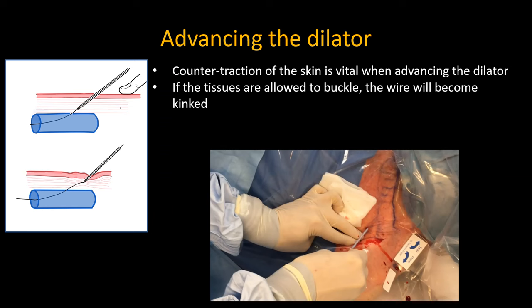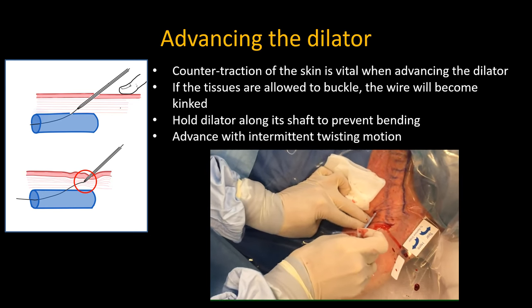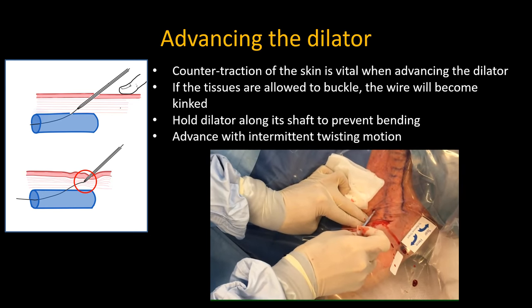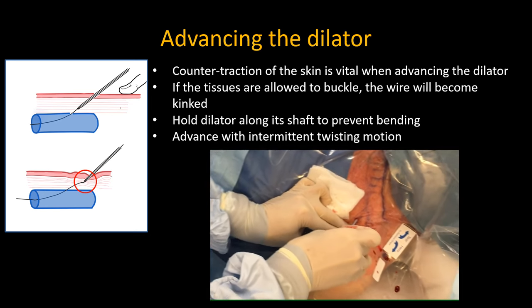It is also critical that you apply counter traction on the skin with the non-dominant hand when inserting the dilator over the guide wire. If you allow the tissues to buckle or the catheter to bend, the wire may be kinked. At no time must the dilator be allowed to bend as it is advancing through. Hold it along its shaft, not at the hub, and make short corkscrewing motions to advance the dilator cleanly through the tissues.